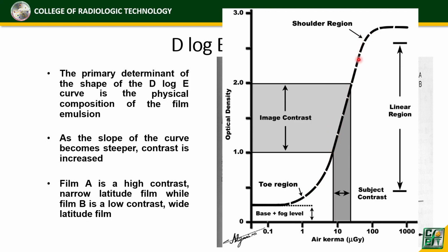Okay. Then the toe region, the shoulder region. Okay. Dito yung visible natin, image contrast.